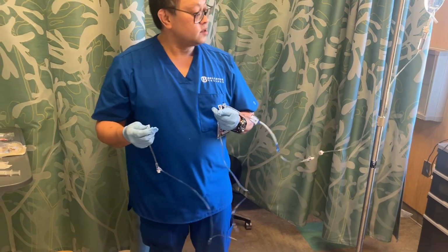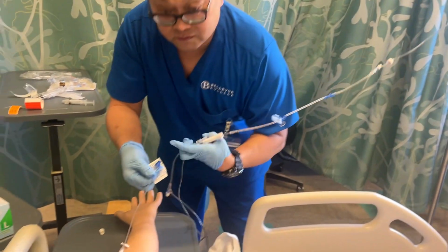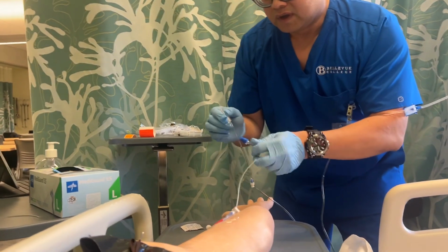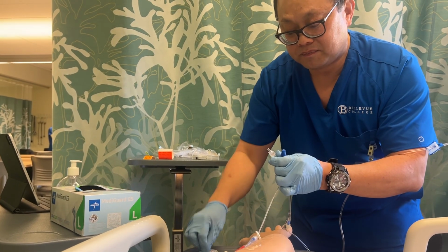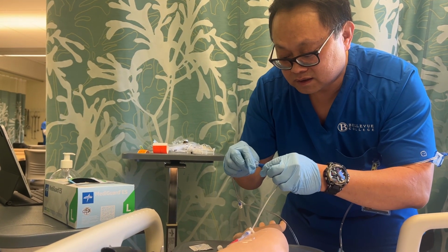I'm going to lock it. And again, I'm going to open the port, scrub for 15 seconds, let it dry for 5. Okay, undo this cap. Okay, now I'm going to carefully connect the port.